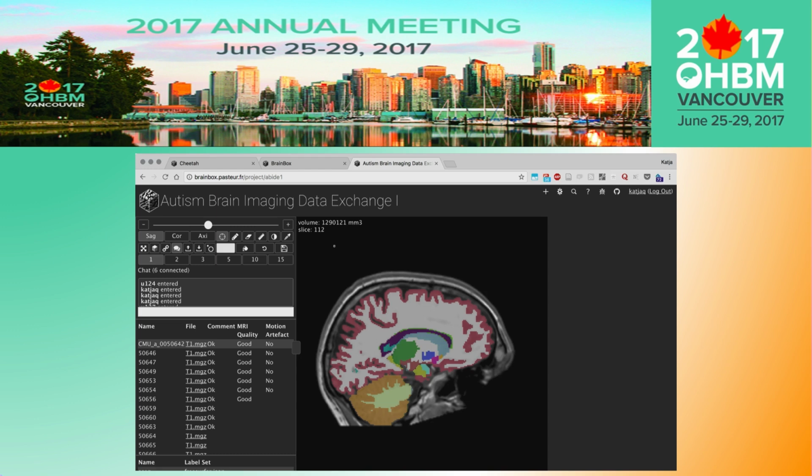You can also upload masks that either you have computed in advance and that go with your data, or you can create a new layer of annotation for your MRI data. You can see that you can also add text annotations, like the quality of the MRI data or the quality of the segmentation that has been generated, and also several layers of volume annotations for the different structures that you might be interested in, or the different projects that might use the same MRI data.